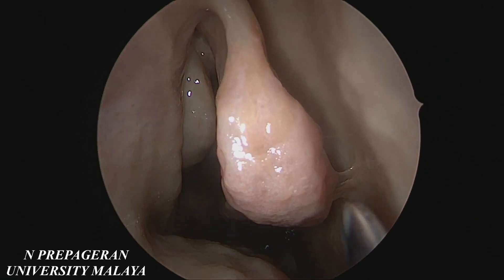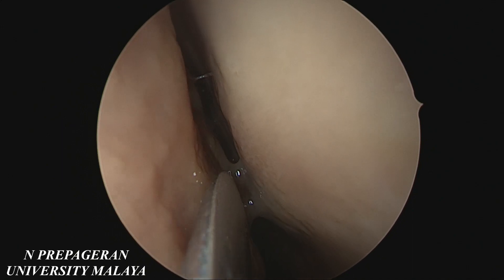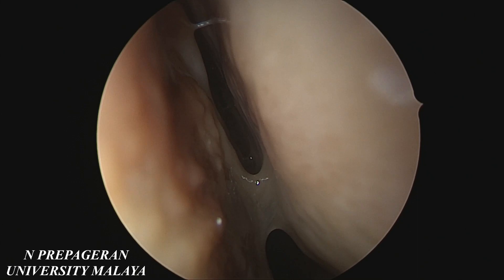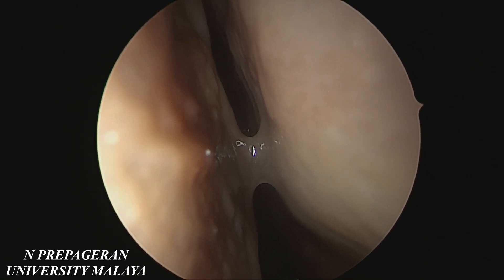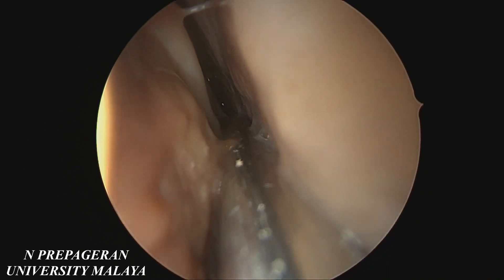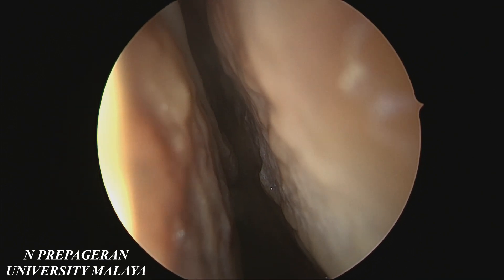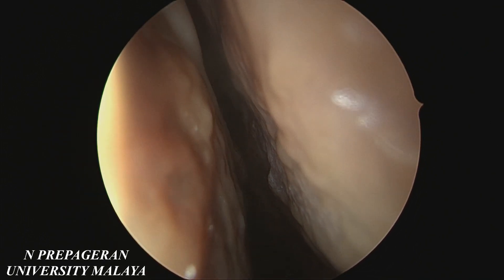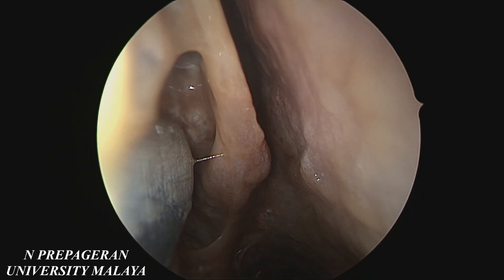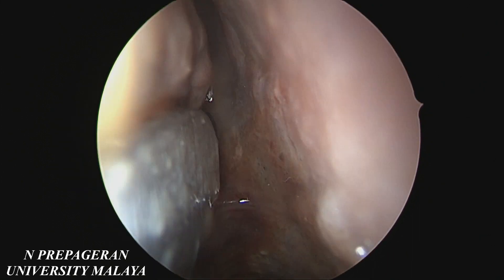If you want to go to the sphenoid sinus to the natural ostia, you just have to go medial to the turbinate. You will see the superior turbinate there, and then we will go along the posterior or the superior turbinate. That's the superior turbinate where the posterior ethmoid opens up. And then if you go midway, you should be able to find the sphenoid ostia.